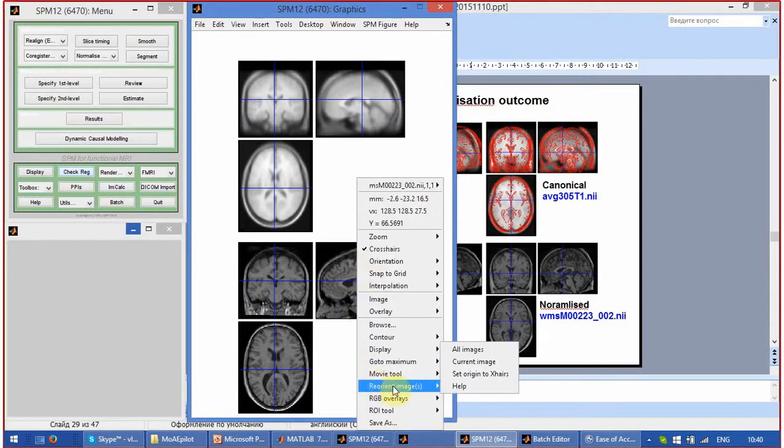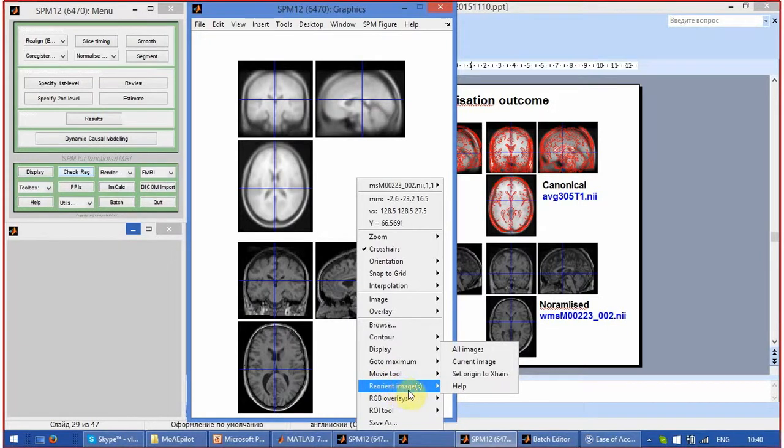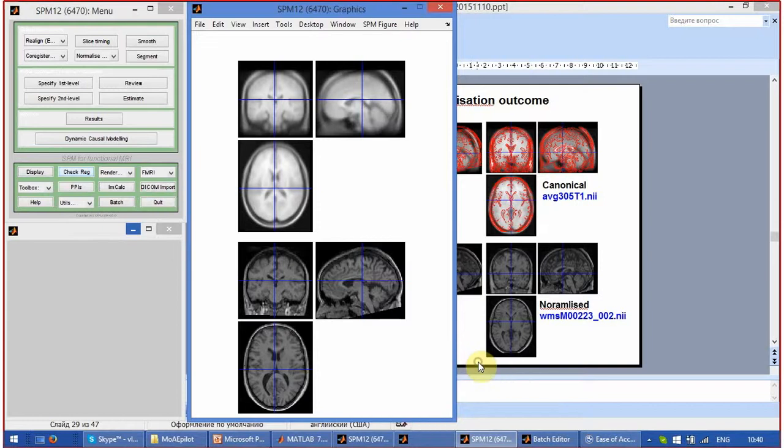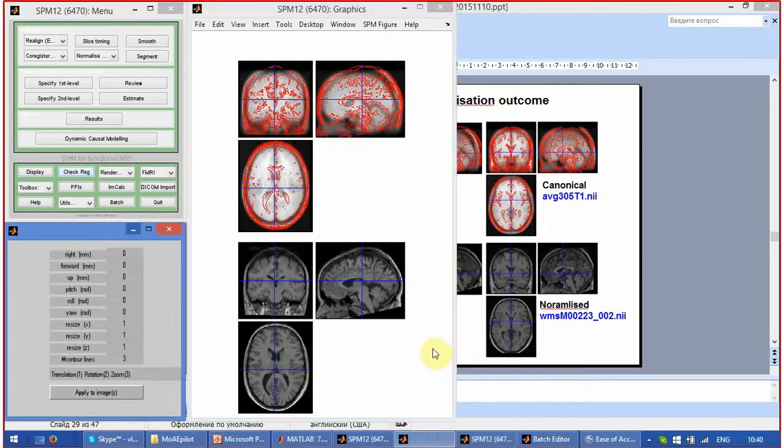To see the better difference between the shapes of two brains, click reorient images at the bottom image and select current image.